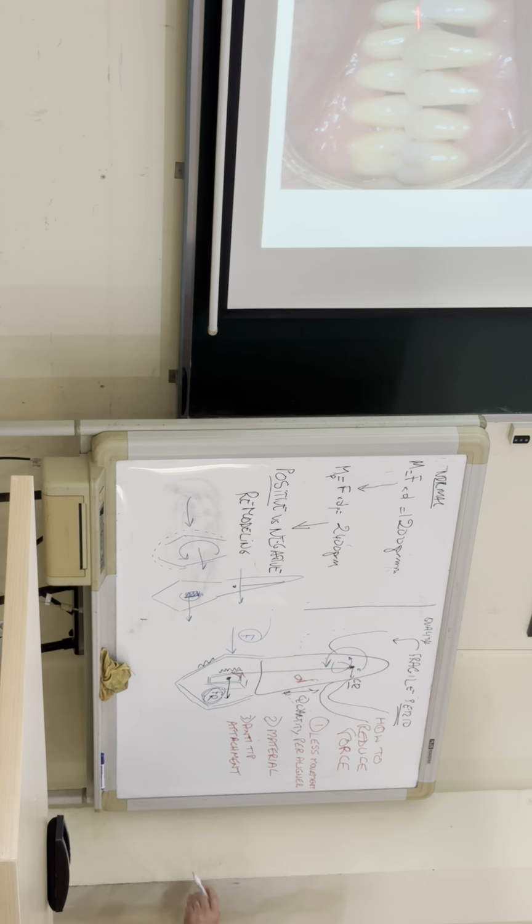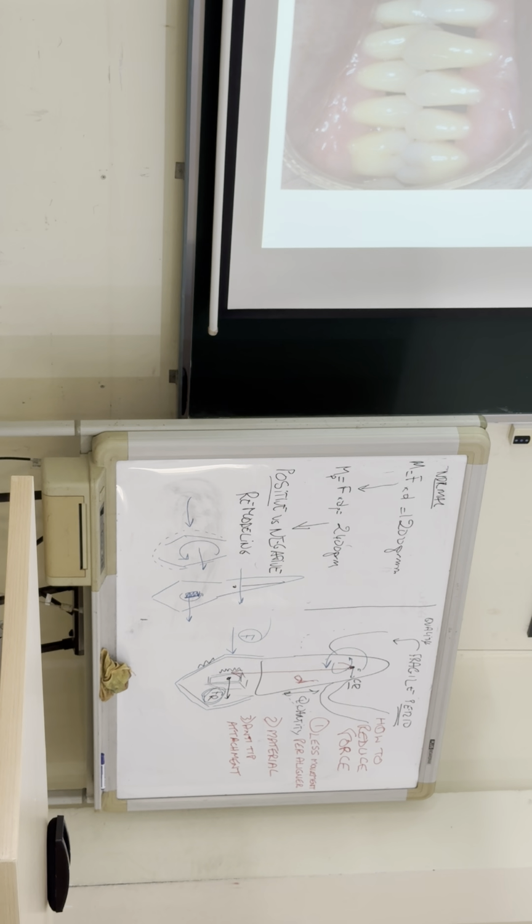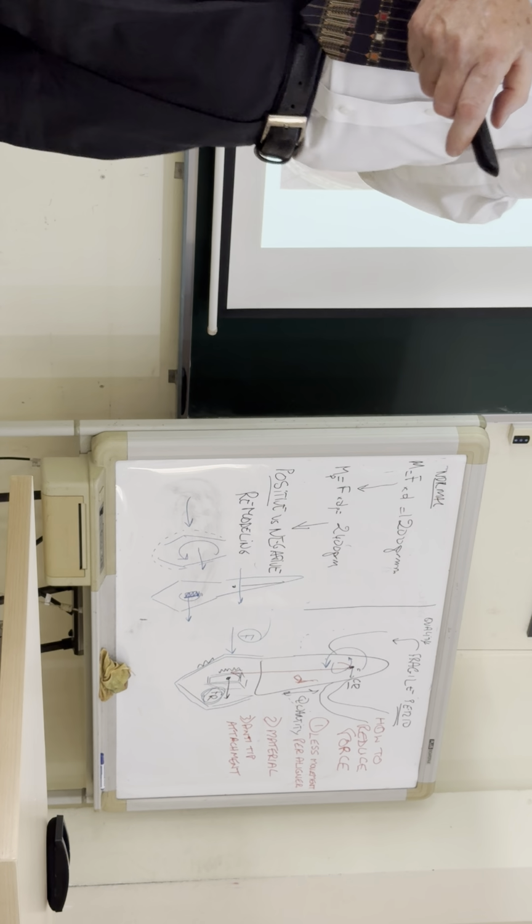So that's a comparison case that was done for my friend the periodontist. After perio, many times he had a big black triangle. The person didn't come to see me for crooked teeth, he has straight teeth, which was interesting. The big advantage is he has very long teeth. So we did aligners on him, and just to close this, he had 35 aligners.